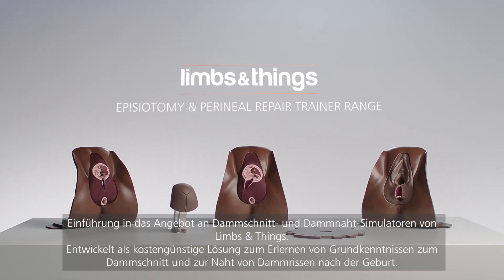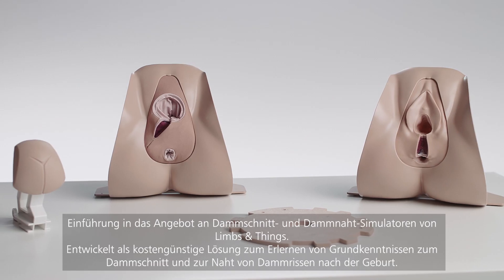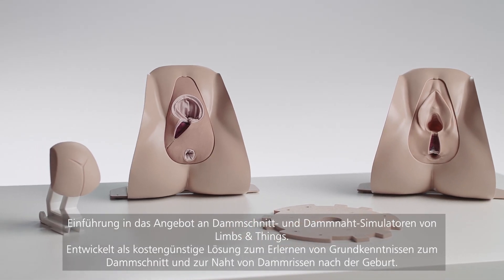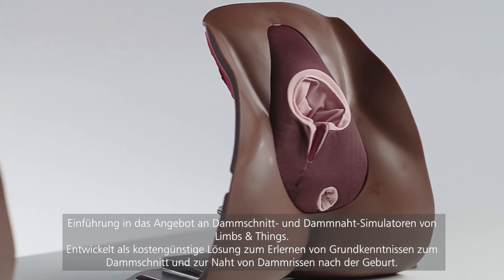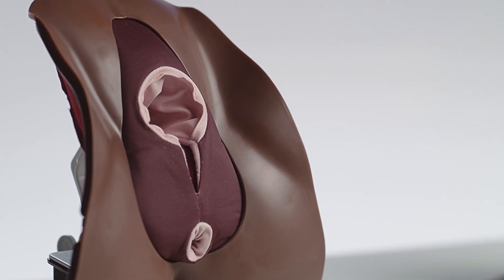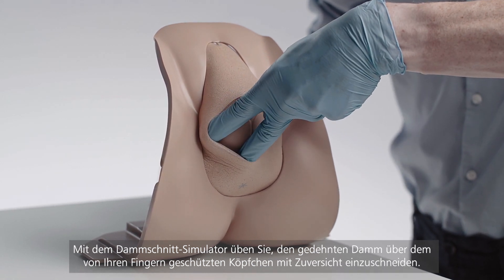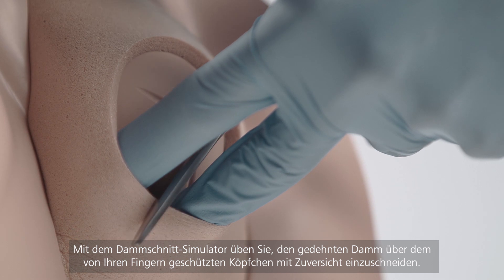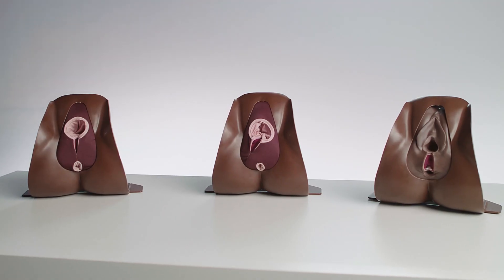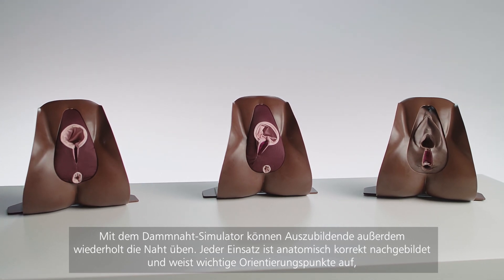Introducing the Limbs and Things Episiotomy and Perineal Repair Range. Developed as a cost-effective solution for core skill acquisition in both episiotomy and postpartum repair of perineal injury. The episiotomy trainer promotes increased confidence in incision of a stretched perineum whilst guarding the baby's head. The perineal repair trainer allows for repeated practice of suturing techniques.